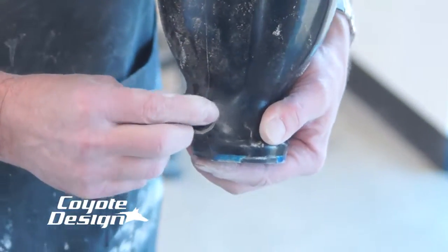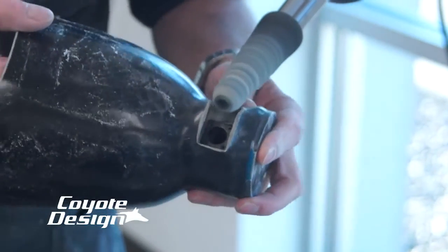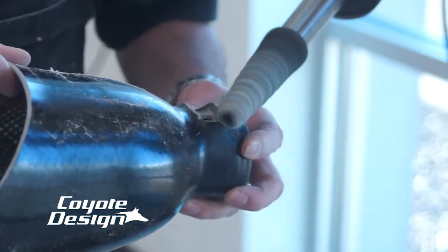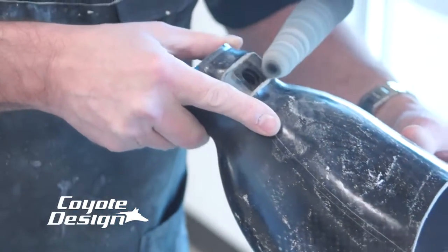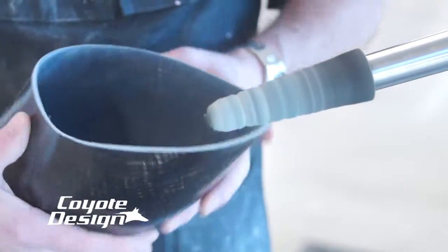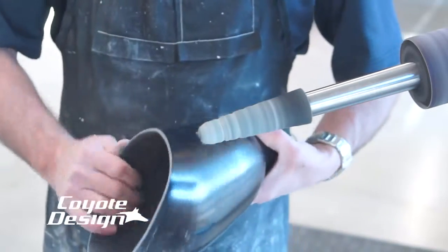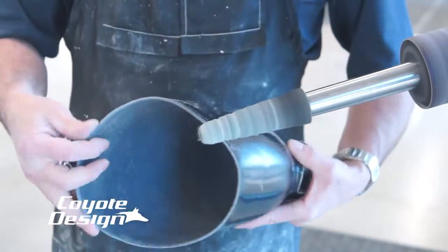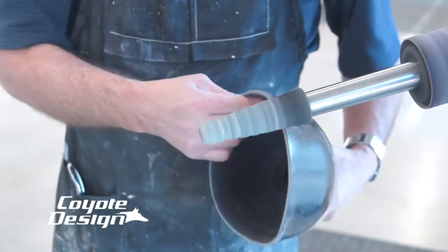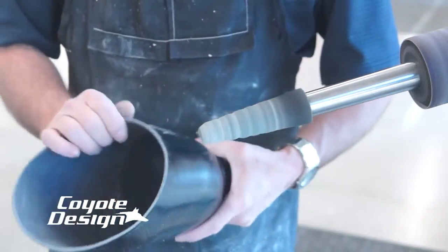Yeah, that looks better — now you can get your finger in there a little easier. I've got my wheel on slow; that works out just fine for smoothing that up. Light blue-green scotch-brite wheel — that nice slow wheel works really good on smoothing up that composite, just that epoxy. That feels good.